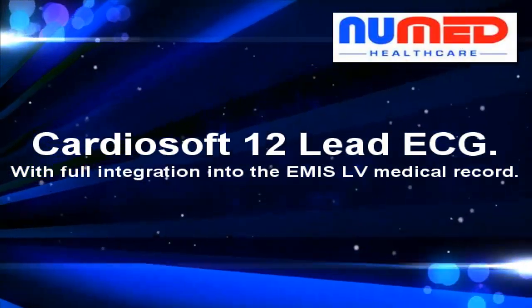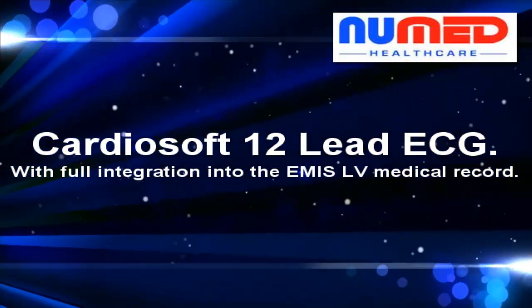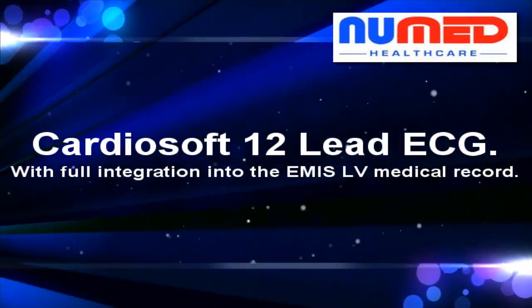This is the easy user guide for CardioSoft with full integration into the EMIS-LV medical record system.